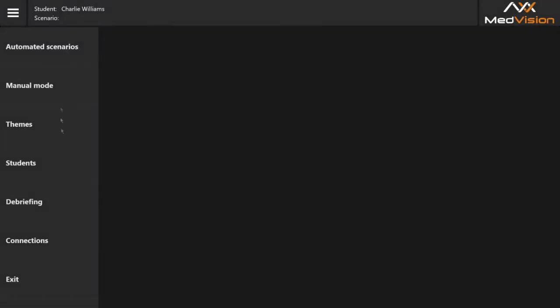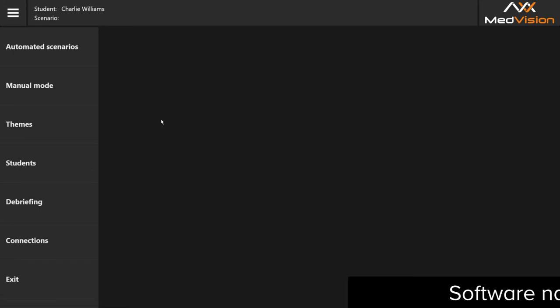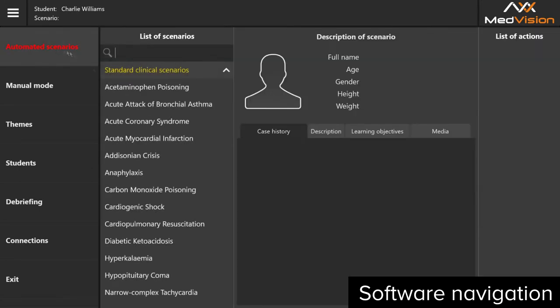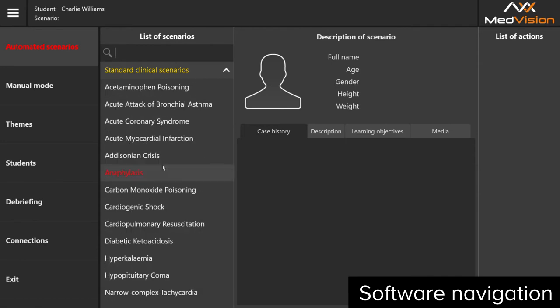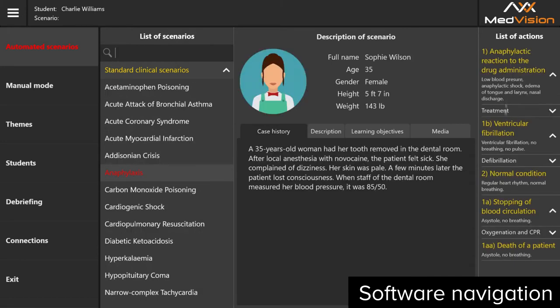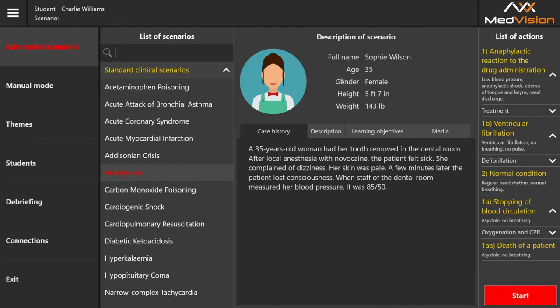Let's have a closer look at our software, going through features one by one. First, automated scenarios — pretty self-explanatory. You have a selection where you must perform certain actions to reach a certain outcome, or if you don't, you get a different outcome naturally. Each scenario shows a description, name, age, gender, height, and weight.